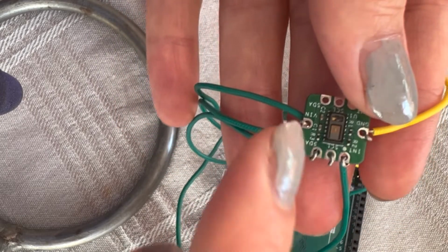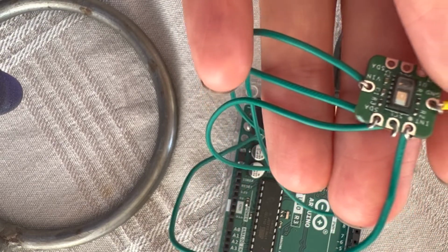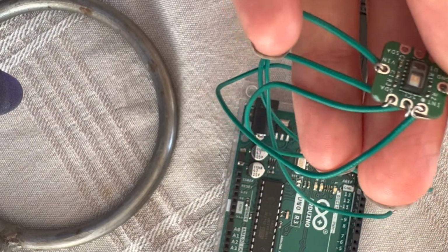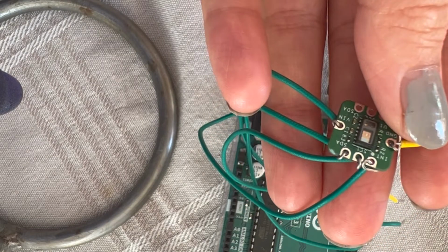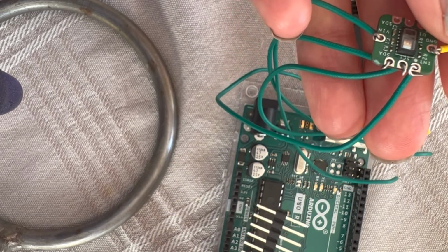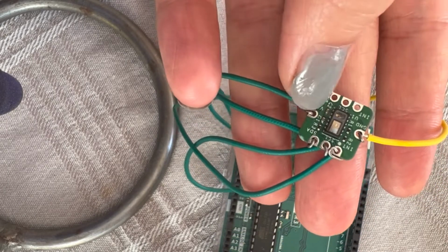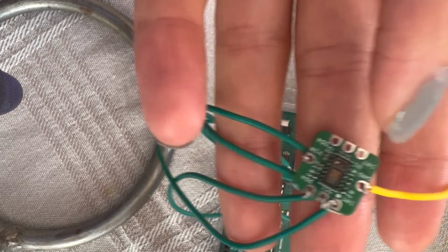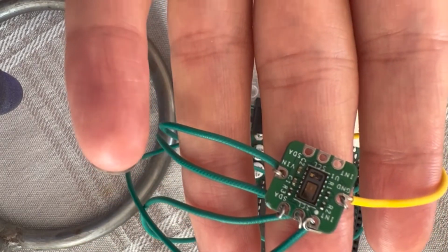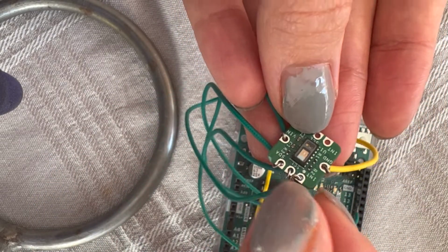The boring part with this one is that it doesn't have the pins connected to it, so we needed to just connect it directly to the wire. Actually, I had some other pins as well to connect it with. You can try these ones as well and connect it to the breadboard, but make sure that it doesn't move. Well, in my case, it was moving actually, so the sensor was losing the connection constantly. That causes the values to be inaccurate. So it's better to make it this way. I just used simple wires and connected these parts the way you see, bend them over.